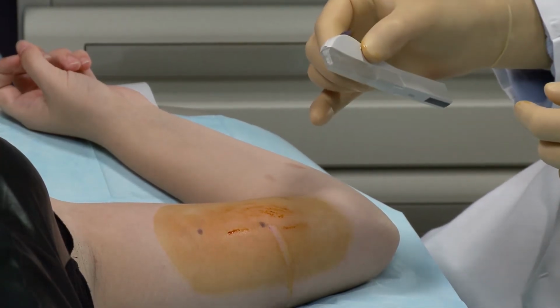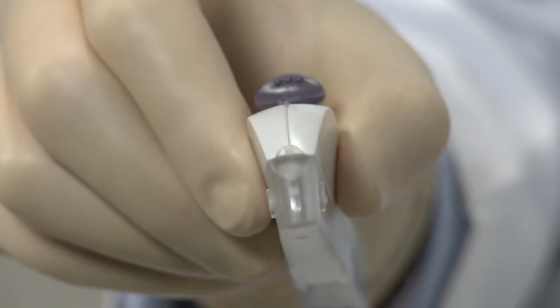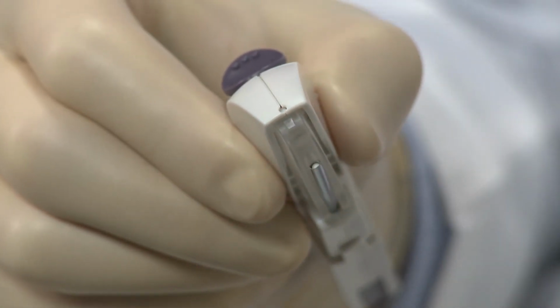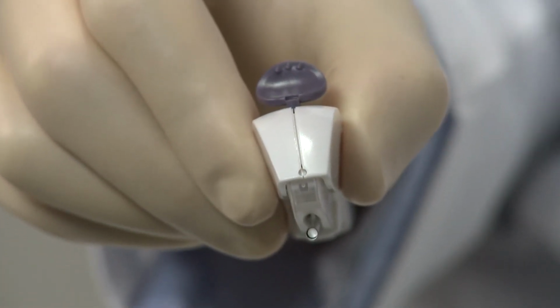Hold the applicator just above the needle at the textured surface area. Remove the transparent protection cap by sliding it horizontally in the direction of the arrow away from the needle. If the cap does not come off easily, the applicator should not be used. You can see the white implant by looking into the tip of the needle. Do not touch the purple slider until you have fully inserted the needle subdermally, as it will retract the needle and prematurely release the implant from the applicator.